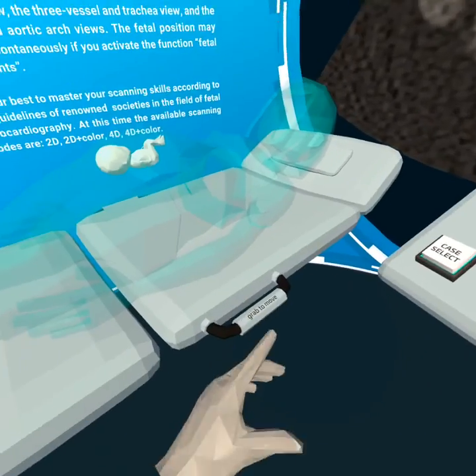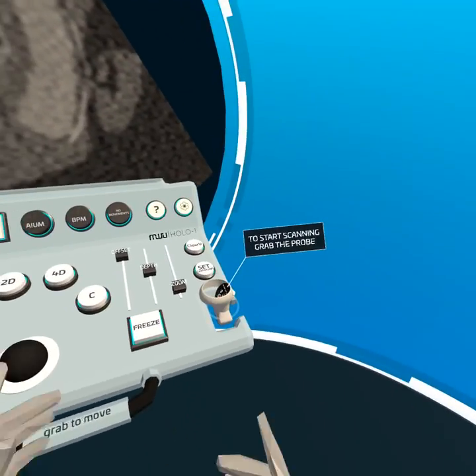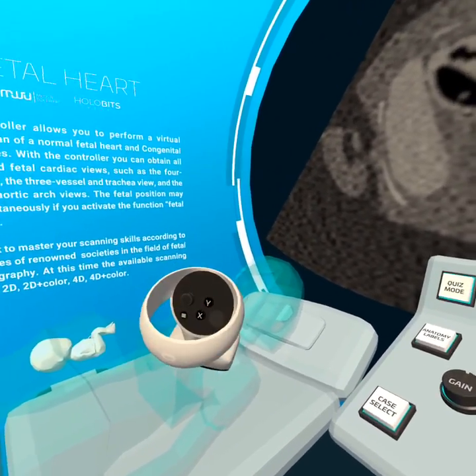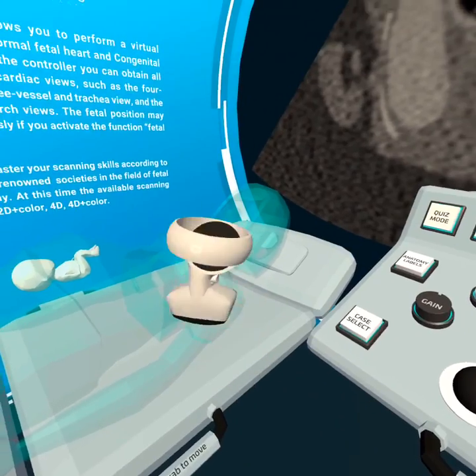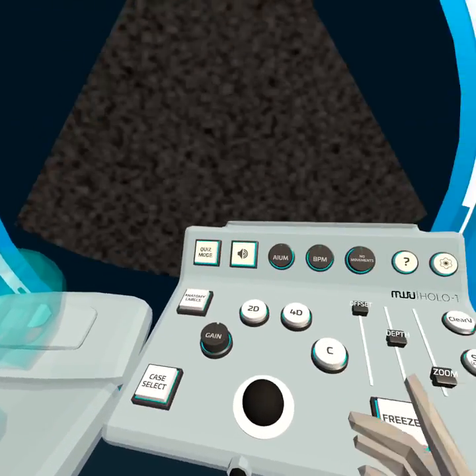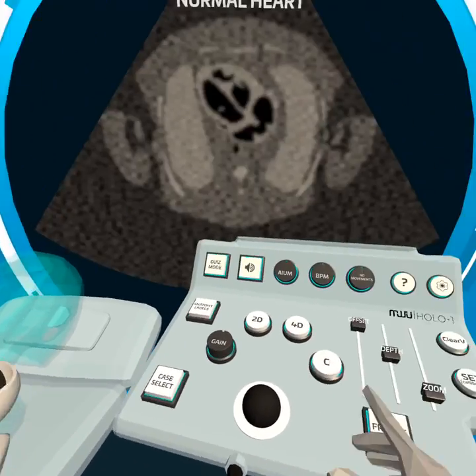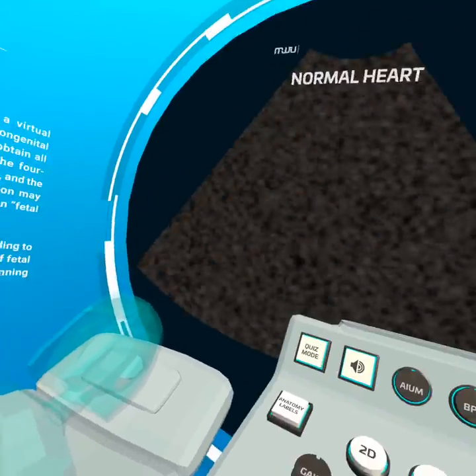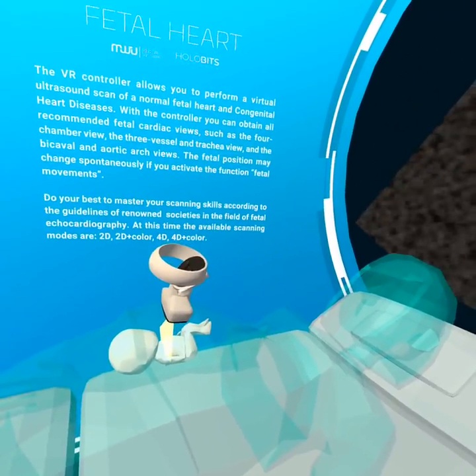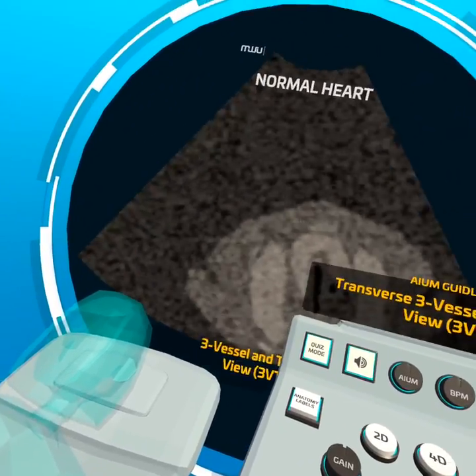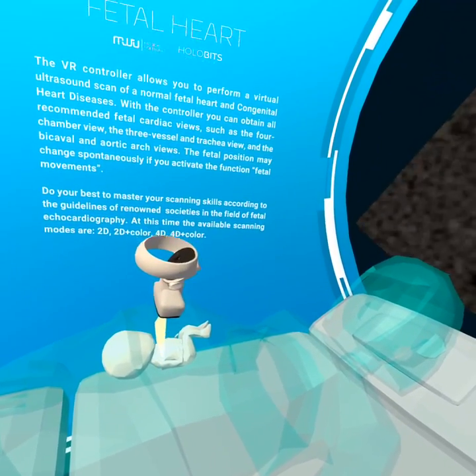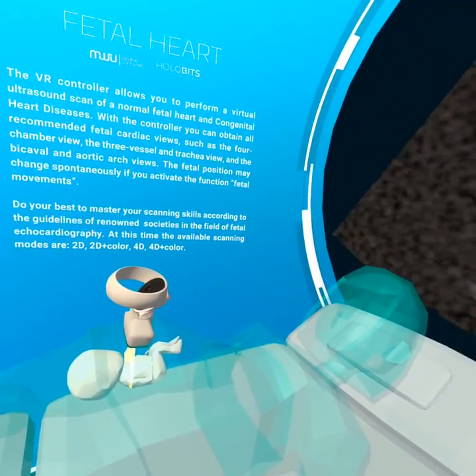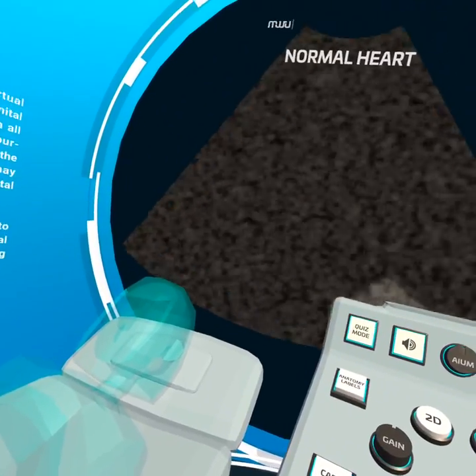To start scanning, grab the probe. I can also move this around. I'd really like to have explainers for the buttons here — I remember there was a freeze command and other things too. I'm just going to go ahead and try to find the heart. Found it! There are no haptics — I would really like to feel haptics, and they could do something cool like simulating the heartbeat of the baby, but nothing.